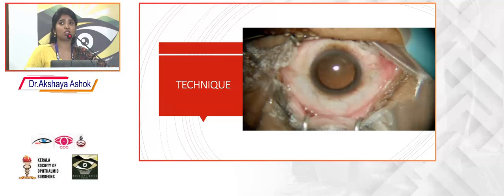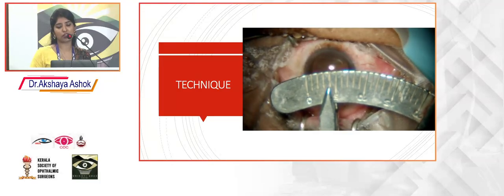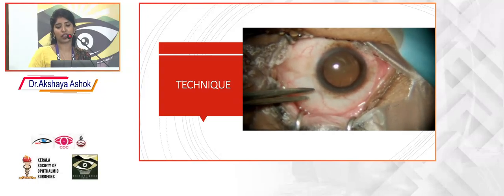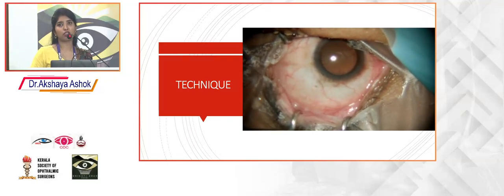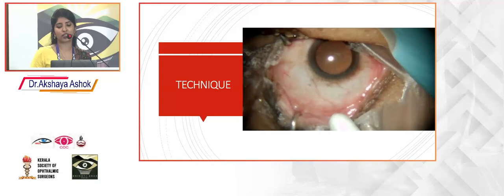And it's always better to get the eyes dilated before the injection, so that you can see the needle as it enters the globe. Now, you take the measurements using a caliper. Measurements are taken from the limbus: 3.5 mm for the pseudophakic eye and 4 mm for the phakic eye. Once you take the measurement, using a cotton bud soaked in paracaine, you can gently retract the conjunctiva at the site of injection to avoid any vessel if present.